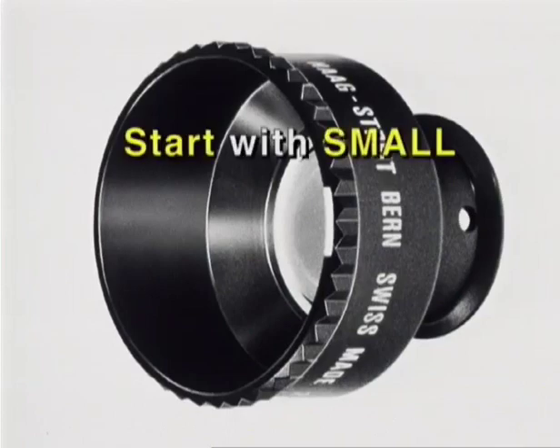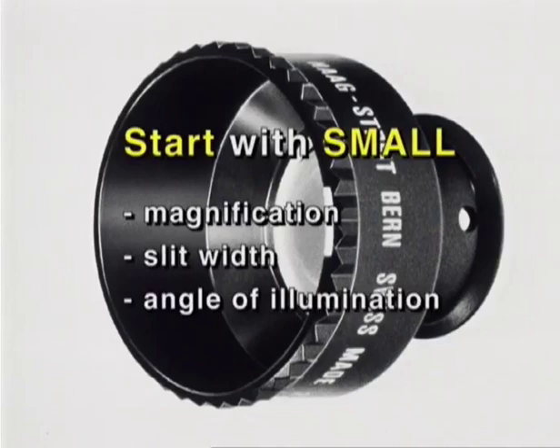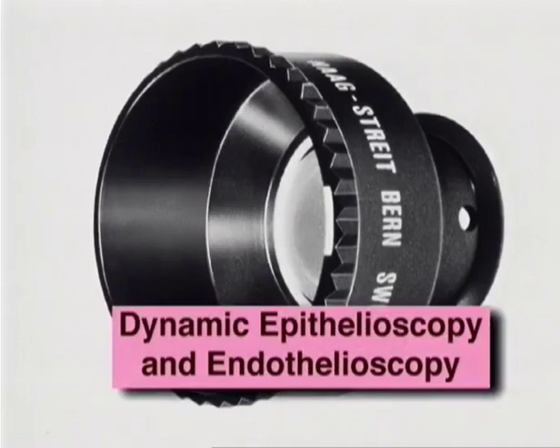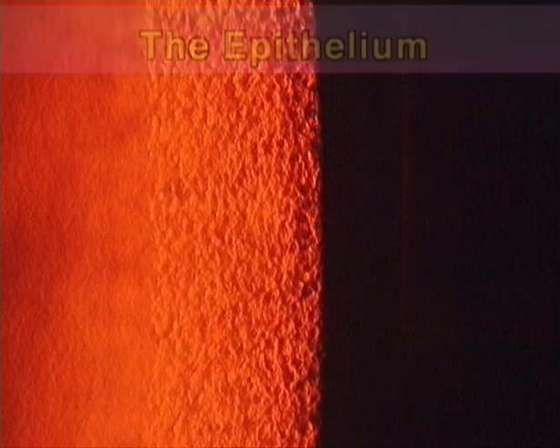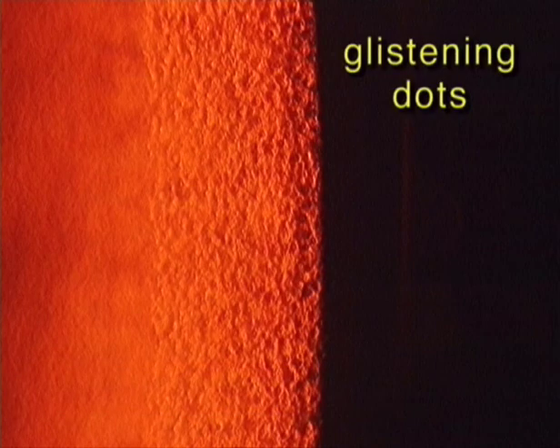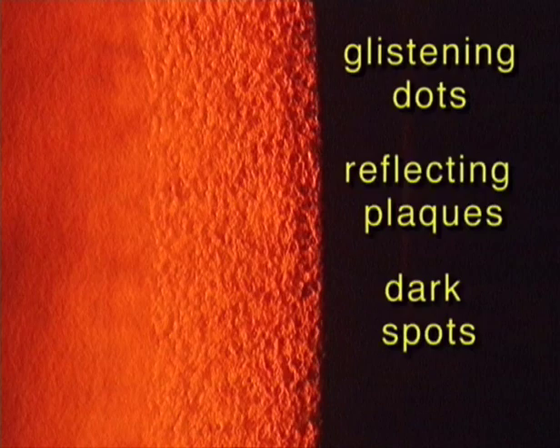To repeat, start with small magnification, slit width, angle of illumination. Examine with large magnification, slit width, angle of illumination. Dynamic epithelioscopy and endothelioscopy. The epithelium. The specular reflex of the epithelium, seen here with a red filter, is present in normal eyes as glistening dots, reflecting spots and plaques, and dark spots, which are all more or less abundant and regularly distributed.